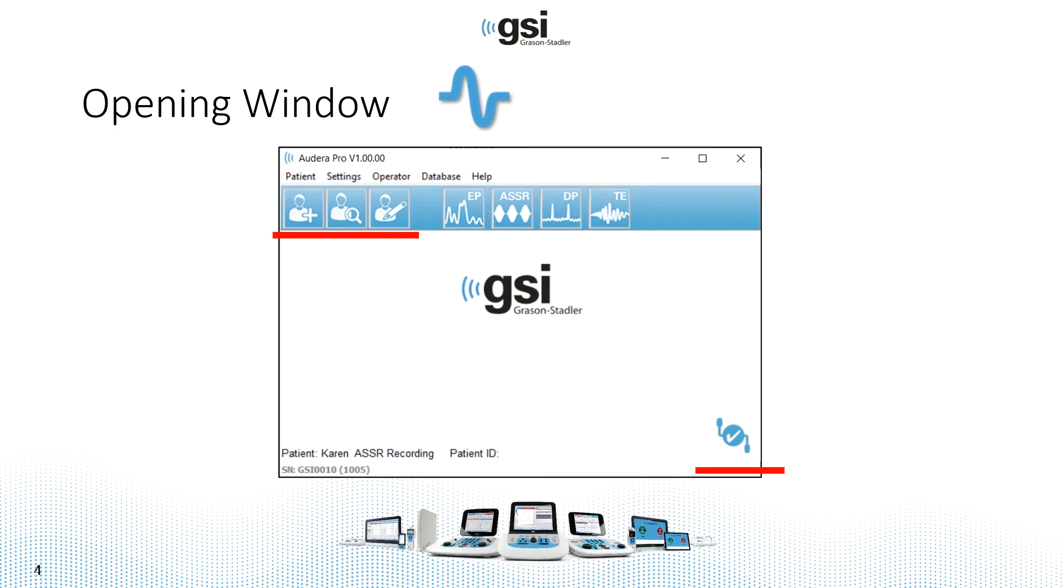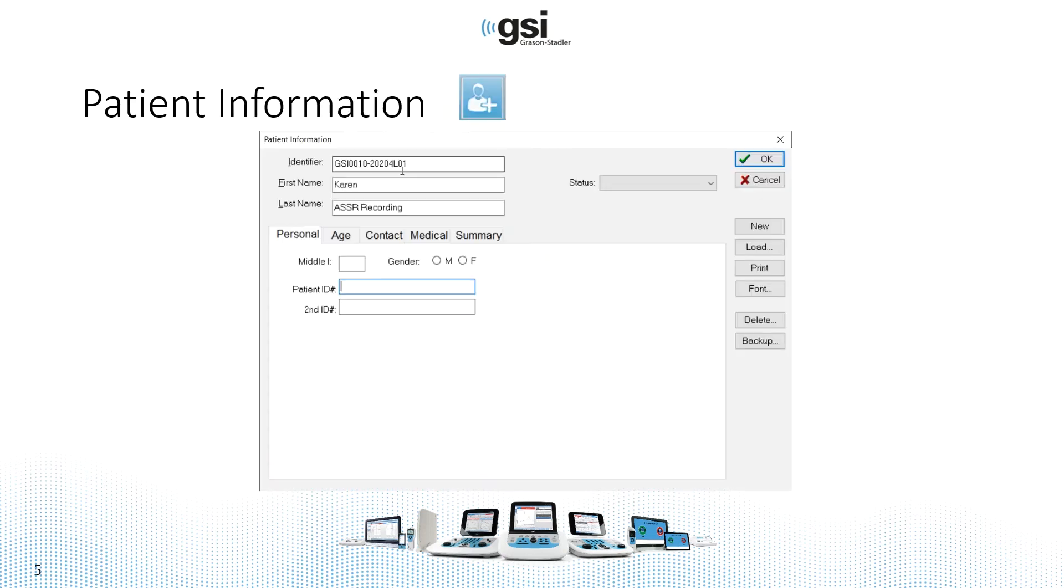If you're in a hurry and you launch the module right away, you'll be prompted to enter patient information, but if you don't, you may risk losing some of that test data. So go ahead and enter the patient information from this screen.